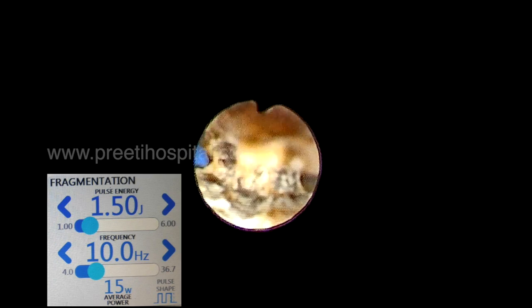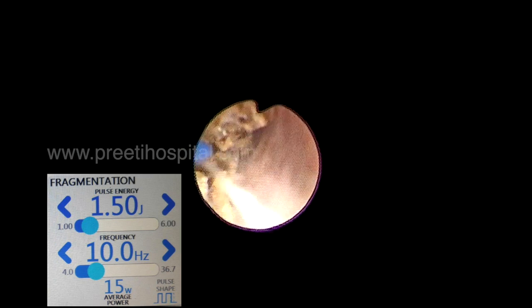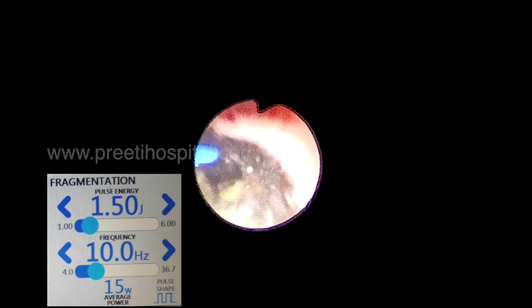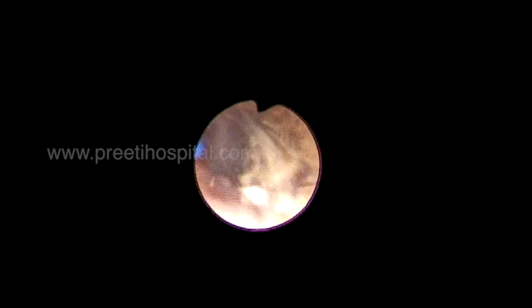Once they become two pieces we can push them into the calyx. Whenever a stone is pushed into a calyx it is getting cornered and we can use high frequency, high energy — especially when outflow is present. One piece is pushed into the upper calyx, and another piece is also pushed into the partially dilated upper calyx while lasing.